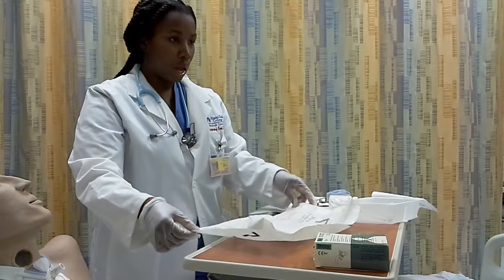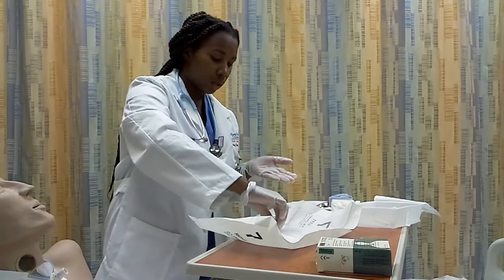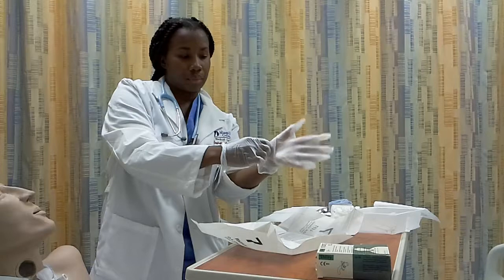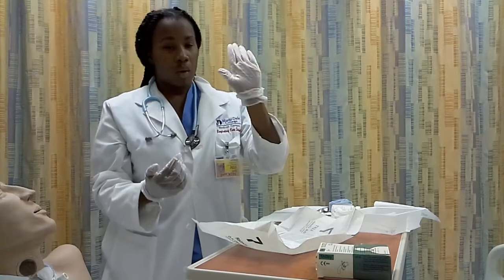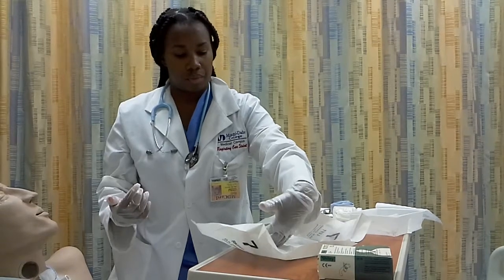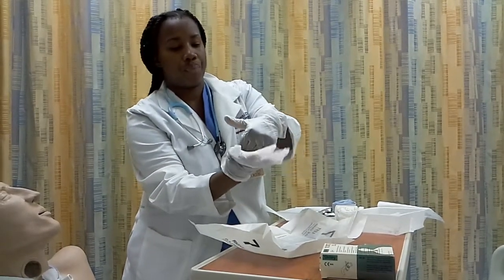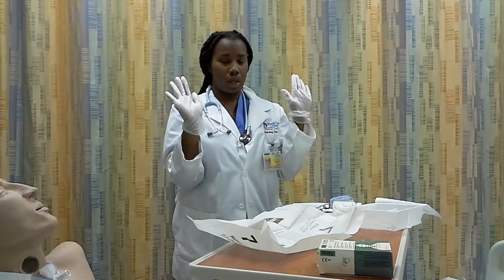Okay. I'm going to make sure that I'm careful the way that I don my gloves to make sure I keep a sterile field. So I'm going to open this side up and stick my hand in, making sure I don't touch the sterile side. Then I'm going to take my sterile side and go on the inside of the gloves so I'm not breaking my sterile field. Then I'm going to put this hand inside. Okay, so now I have my sterile gloves on.